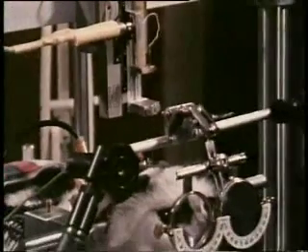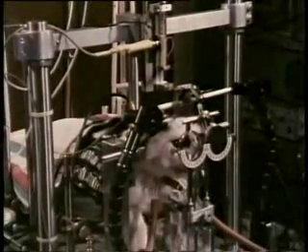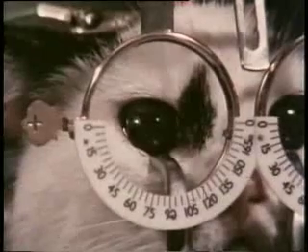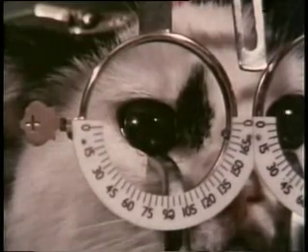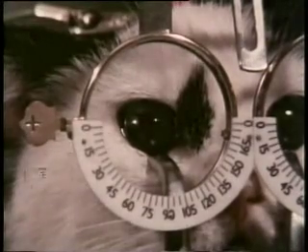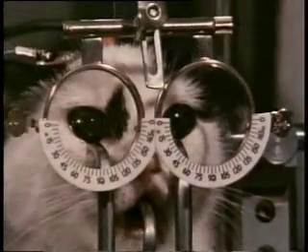This anesthetized cat is fixed in a stereotaxic instrument, and I'm advancing a microelectrode into the visual cortex of the cat's left hemisphere. You can hear the background activity being picked up by the electrode. The cat has a contact lens on each eye to protect the cornea and an extra spectacle lens in front to focus images from a screen onto the cat's retina. The cat's left eye is covered up.